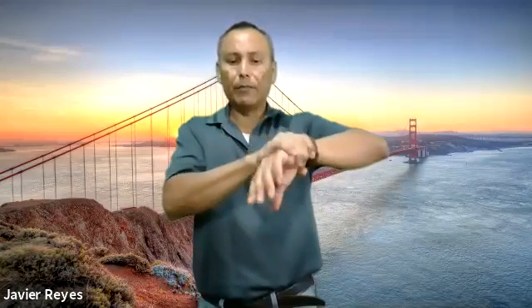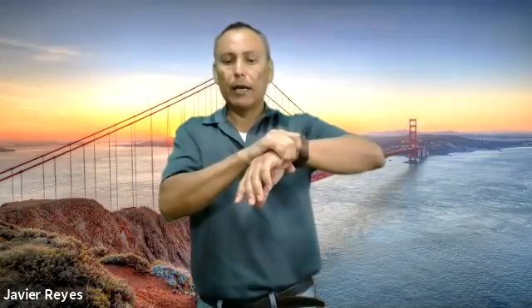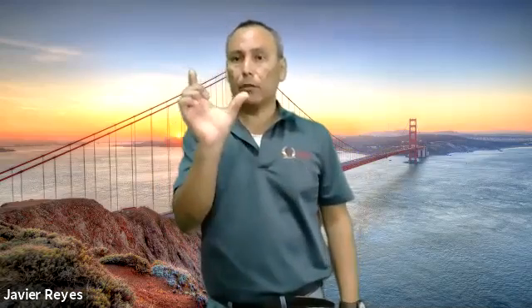Now I talked about three-way ID, okay? To avoid identification and mislabeling errors, some inpatient facilities require what is called three-way ID, in which the patient is identified by three means. Number one, the patient's verbal ID statement. My name is Javier, right? My date of birth is this. The ID band, that's number two, and the visual comparison of the labeled specimen.